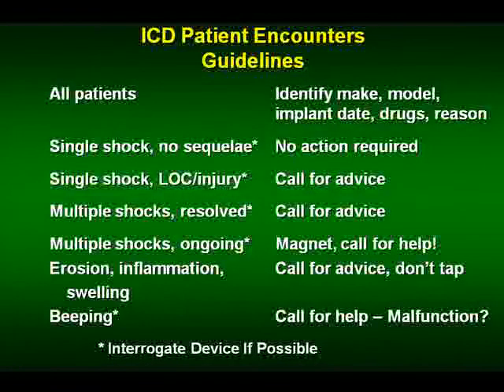Suppose somebody gets a shock. What do you do? Well, you really want to know, for anybody who has an ICD, what's the make, the model, why did they get it, and how long has it been in there? If there's a single shock, no sequelae, you don't have to do anything acutely. If there's a single shock and the patient is injured, well, can we tune the device or add a drug? You probably need advice.